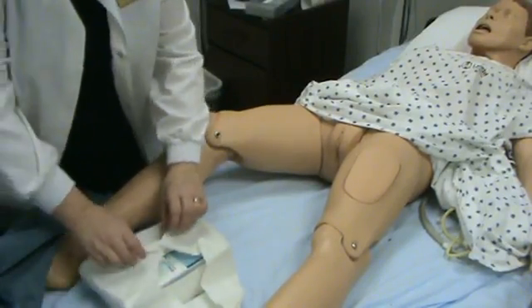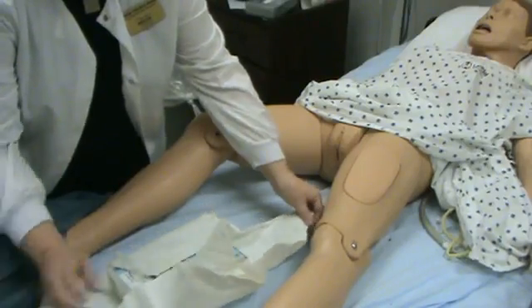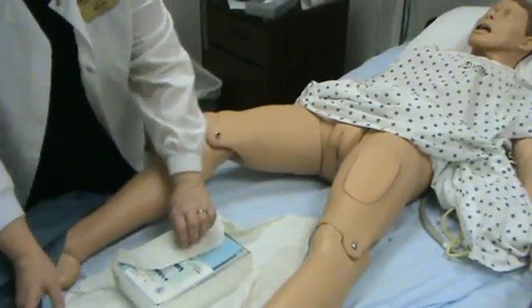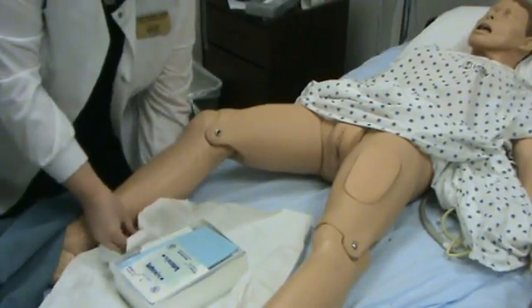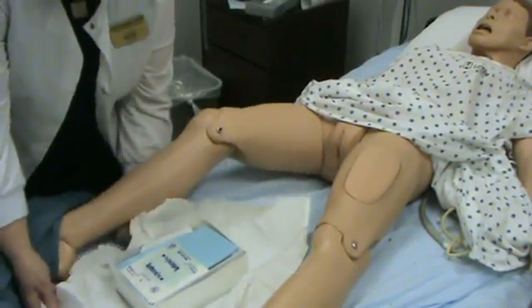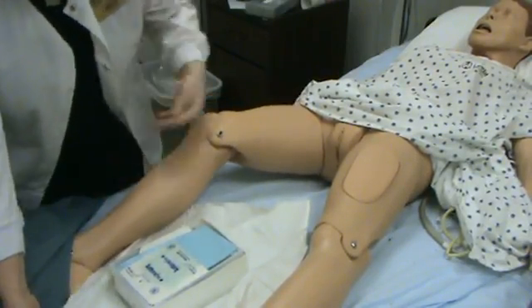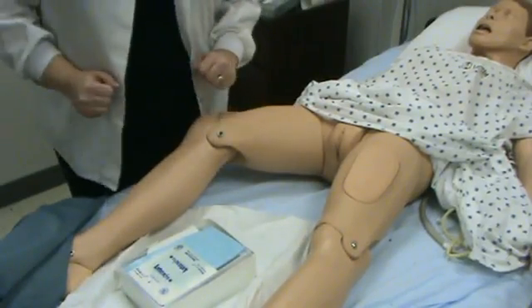You want to open the Foley catheter kit away from you. The best way to keep the ends from coming back on the kit is to just make sure that they are bent under a little bit — it will help. I am trying to set up my sterile site here.